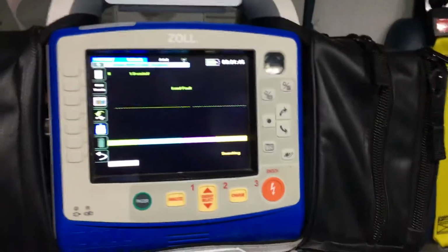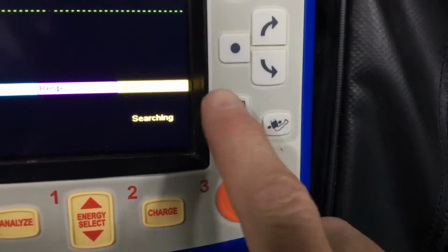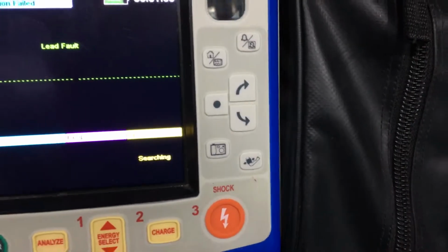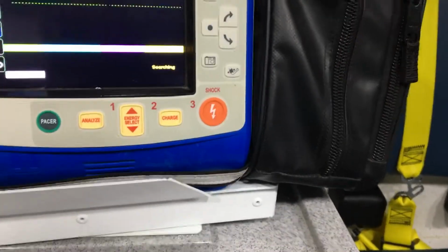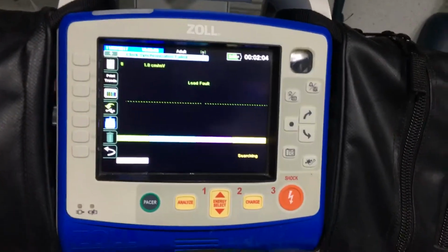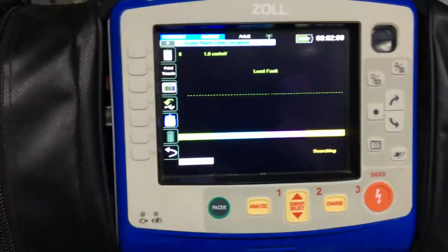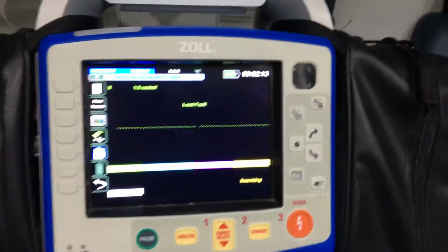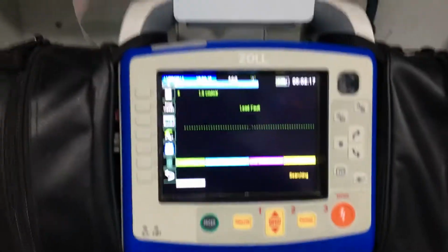So if you need to do a snapshot of your 4 lead, because that's all you've done, that's right there. I believe it gives like a 6-second strip. So you hit snapshot, and that way you at least get a picture of a strip of a 4 lead in your vitals section. Otherwise there won't be any 4 lead strip in your vitals. If you do a 12 lead, it automatically brings it over with that closest set of vitals, so you don't have to worry about that part. That's all there is to importing.